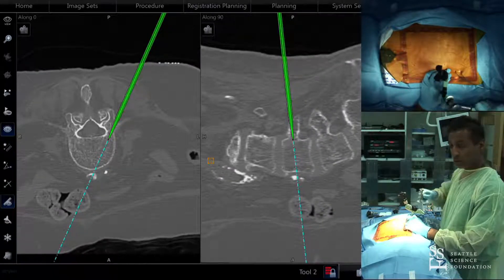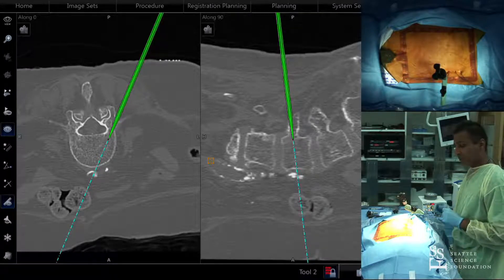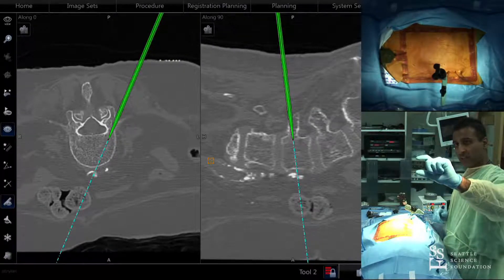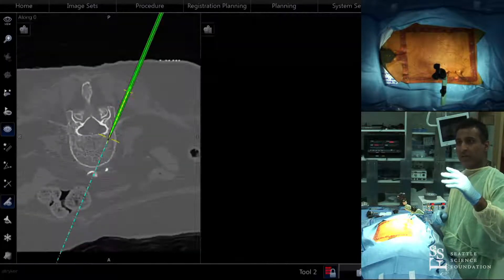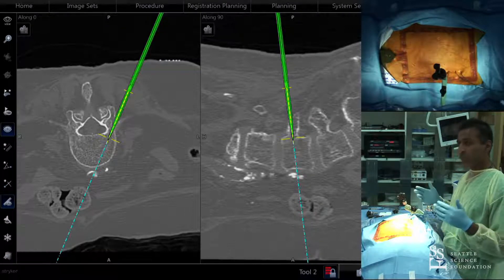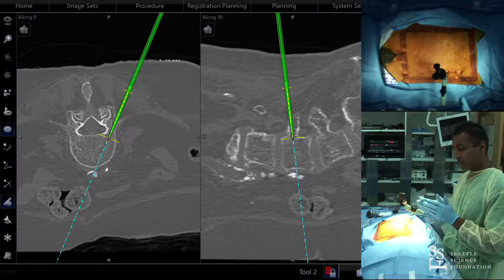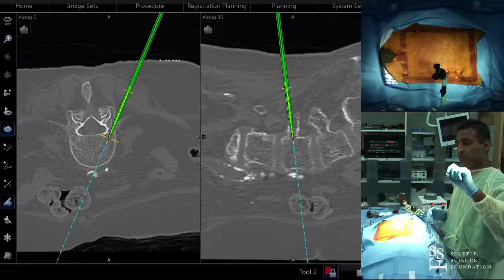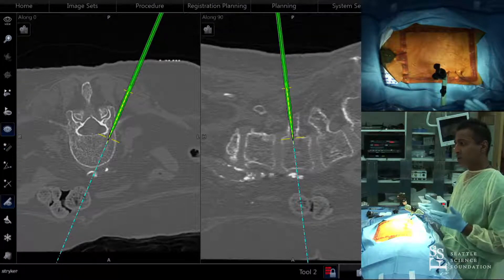I always put my guide wires down first. The Stryker navigation has an ability to capture the trajectory picture with the blue dots and drop that line — so the line is now fixed. You can pick a color: one side at L4, L5, S1 in blue, the opposite side in green. When I come back and do my interbody work, even if the relational bony anatomy has changed from distracting the space, I know that as long as my screws follow those lines, my angles are good, and as long as I go through the guide wires, those guide wires are in the pedicles.